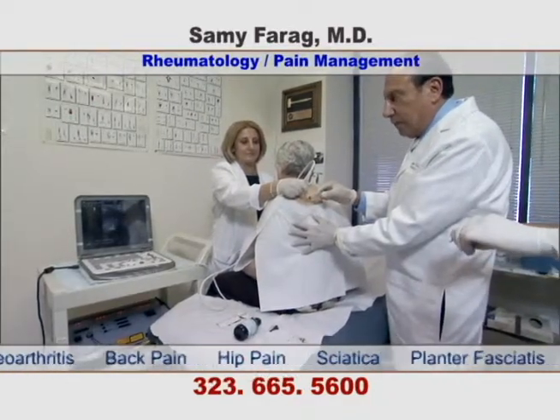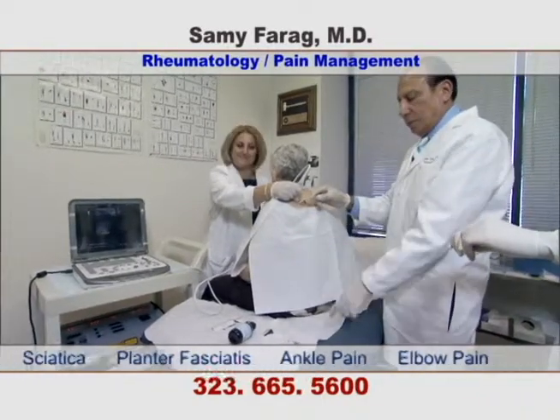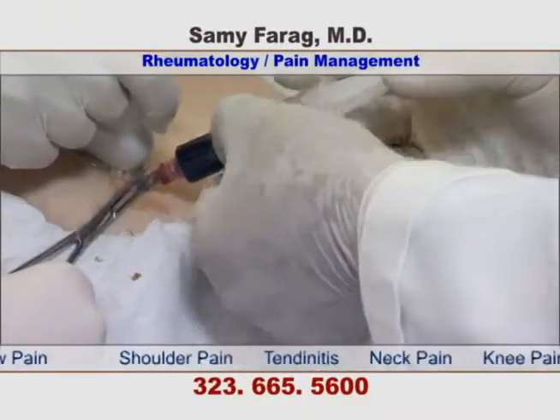Here, the doctor is now injecting the second portion of the PRP into the left area. The injection can be placed precisely into a specific area.